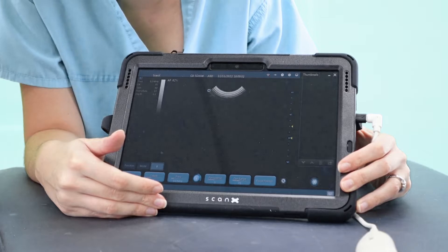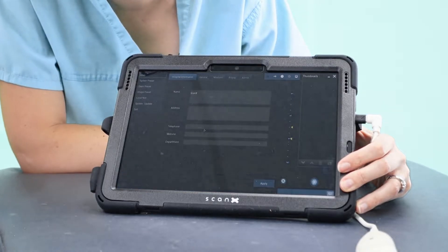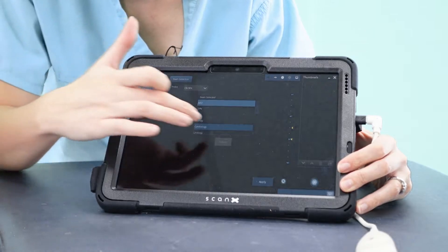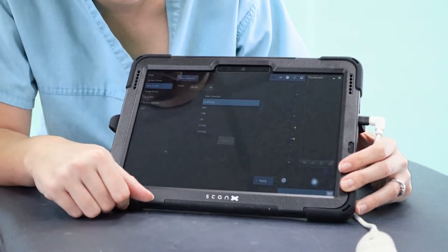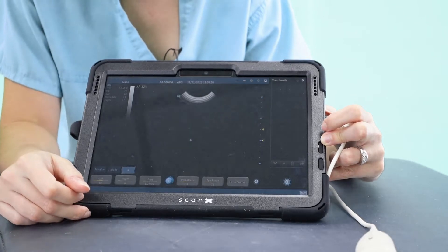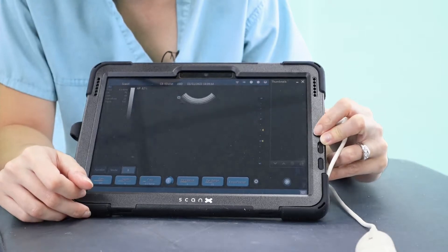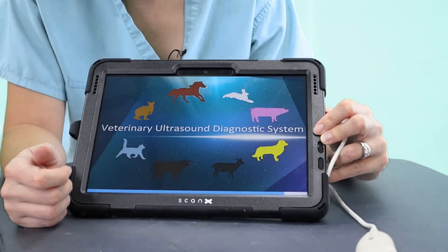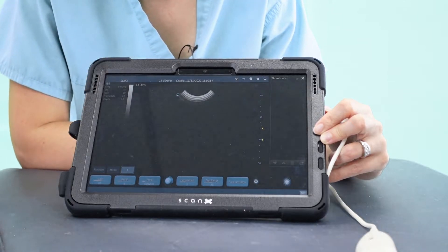If you frequently perform cardiology exams you can set this as your permanent preset. Go to Settings — the cog icon at the top — and go to Exam Preset. Change it to Cardiology and press Default, and it will now be your default scanning setting. Press Exit and OK, then restart the app. You'll see it just there: Cardio instead of ABD or OB.